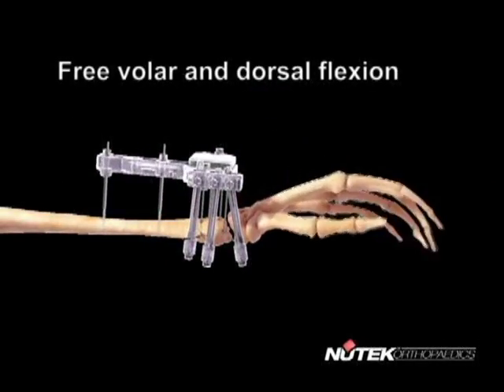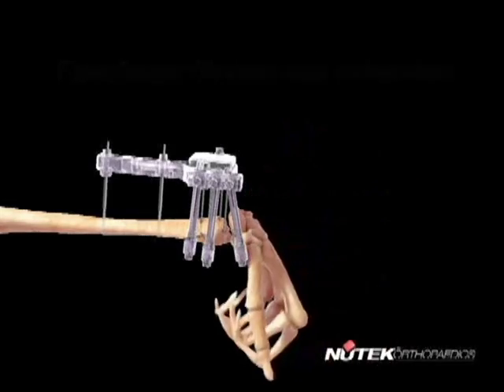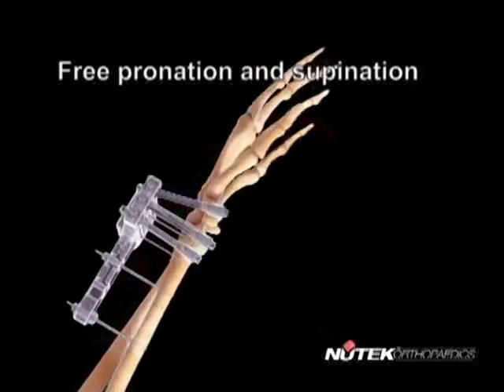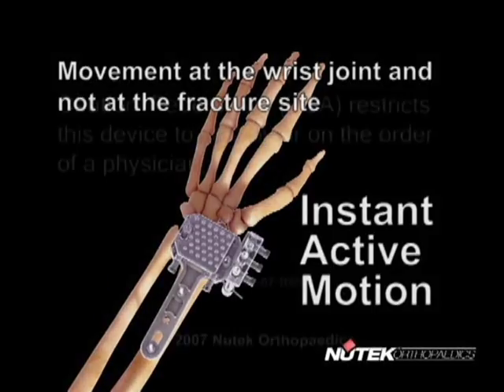There is free volar and dorsal flexion, free finger flexion and extension, free radial and ulnar deviation, free pronation and supination. There is movement at the wrist joint, but not at the fracture site.